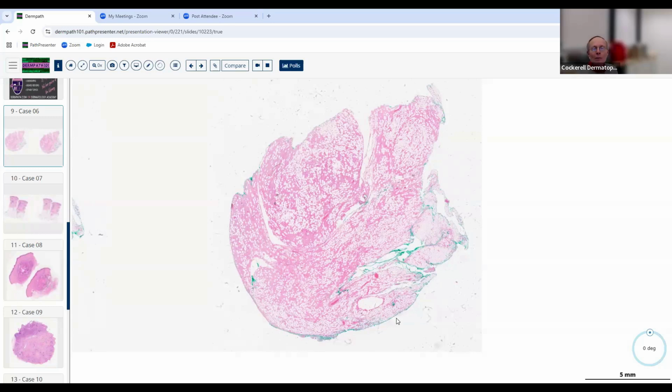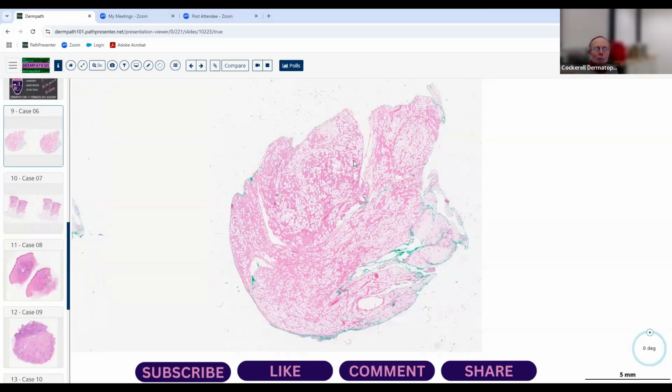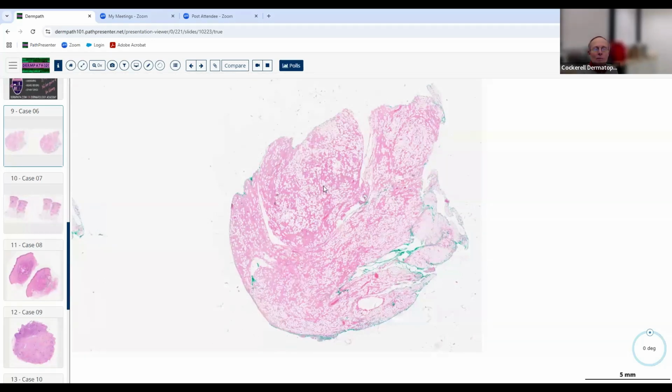So once again, is it inflammatory or neoplastic? Obviously, it's a neoplastic process. And what kind of differentiation is it exhibiting? Well, it doesn't look like it's epithelial. If it is, it's some different kind of epithelium. It's not squamous epithelium. It may have some spindle cells in here as well, but it's got fat in here. So that's another non-epithelial, non-spindle cell type of process.